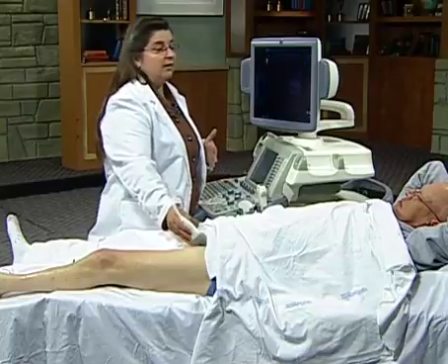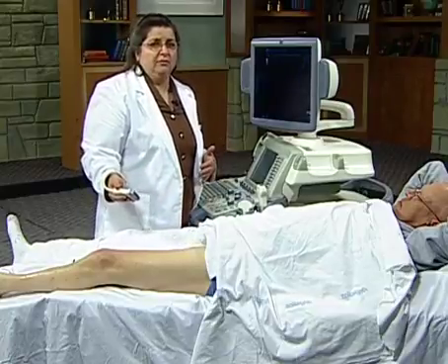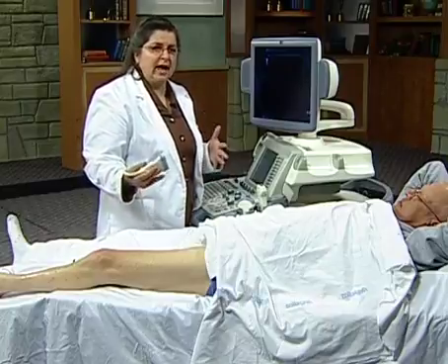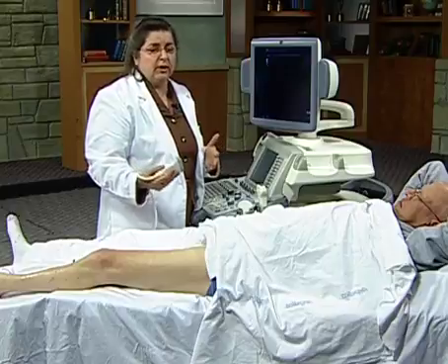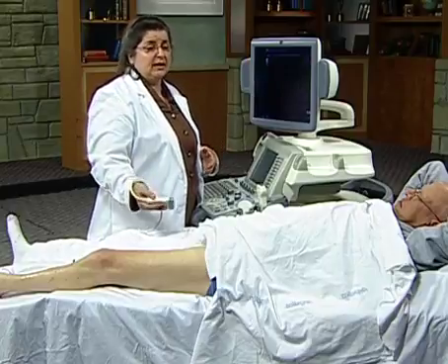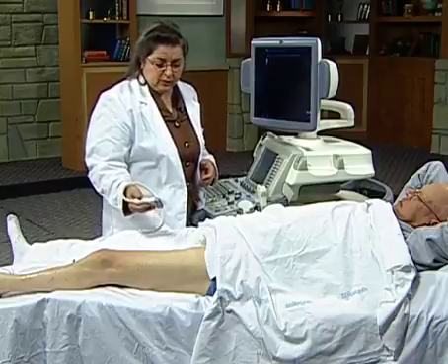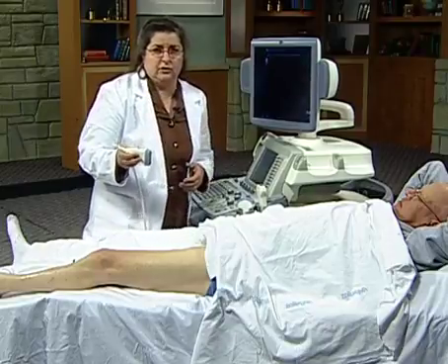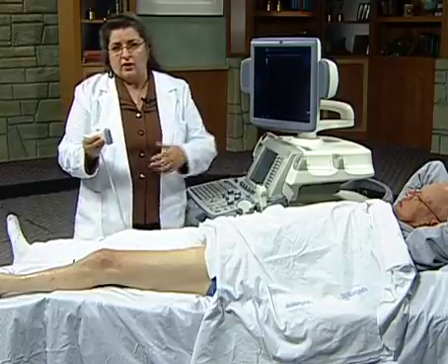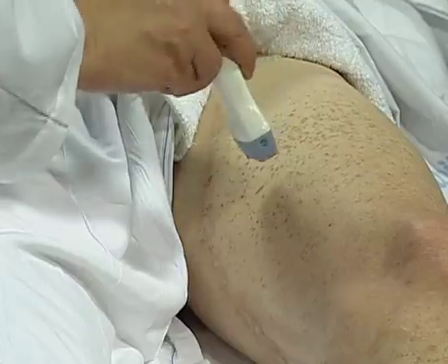Now, when I'm doing the live scan and following things, I may or may not have the angle exactly at 60 degrees. I'm looking and I'm listening, but before I go and capture the velocity, I definitely will make sure that I can get a 60-degree angle. And one of the ways we can do that usually is by toe heeling the transducer, and that's something that a lot of folks don't know about.